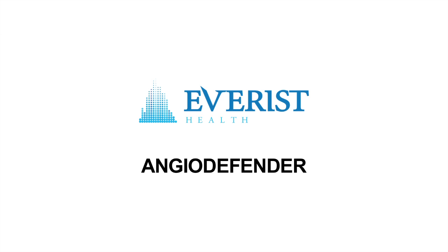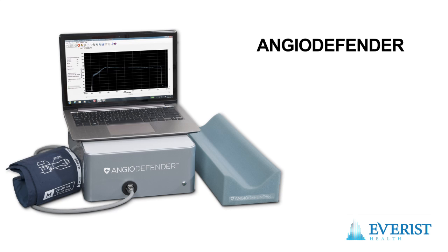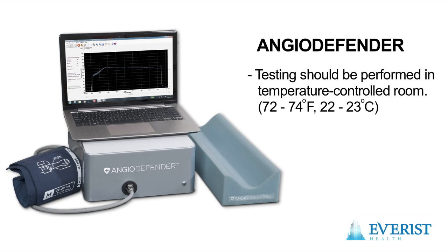This video steps us through the basic operation of the AngioDefender system. AngioDefender testing should be performed in a warm, temperature controlled room.